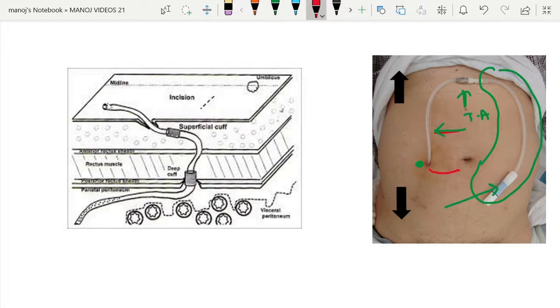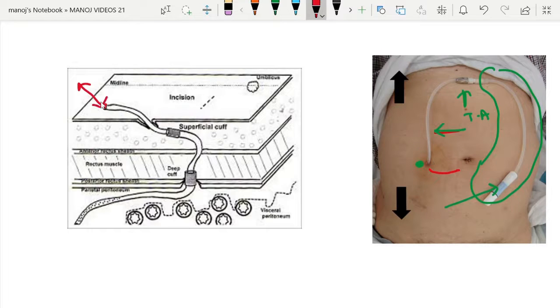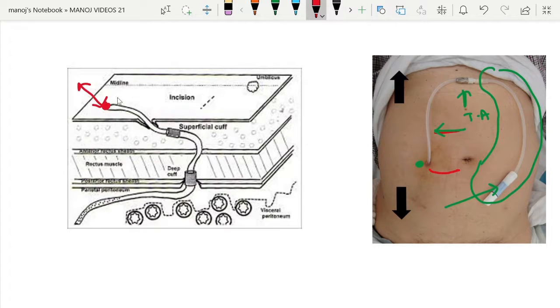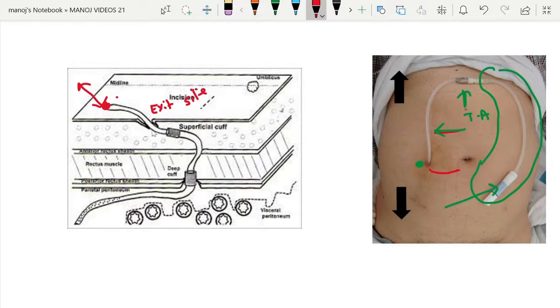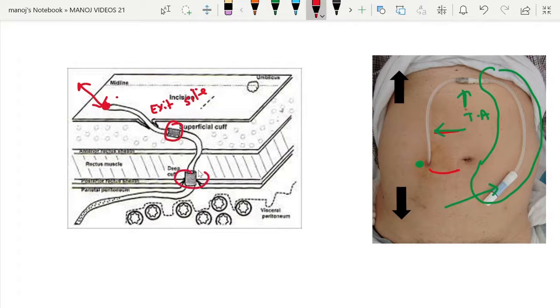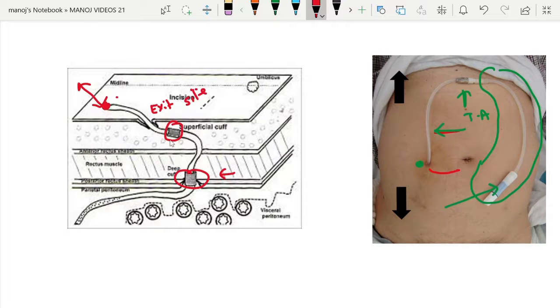Here we can see there are two cuffs. This is the catheter, usually it is 42 centimeters for an adult patient. Here the transfer set is attached in the titanium cap. This is the catheter proper exit site, and there is one cuff over here and another cuff over here.